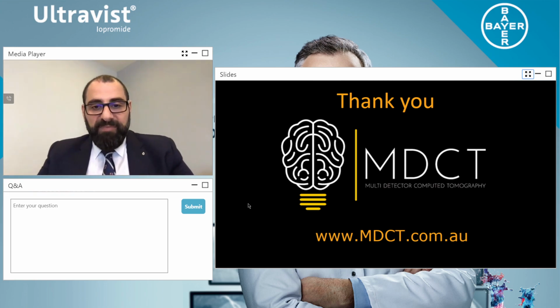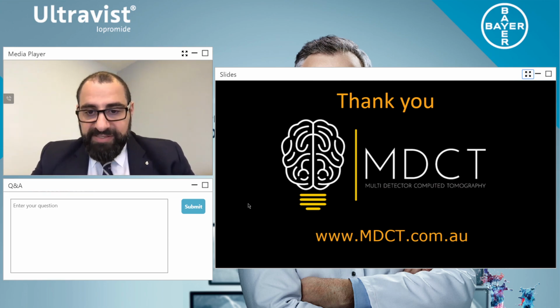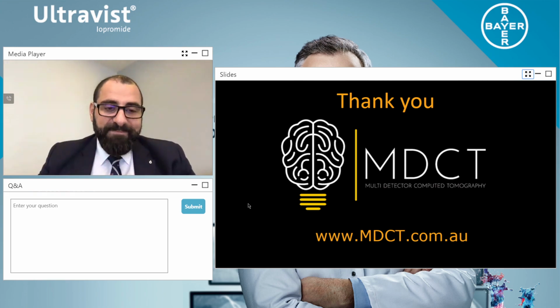Another question from Tsun Wei Hu. As a protocol we use in Hong Kong for liver CT imaging, we only allow for a 5-minute delay. Would you say that that's not long enough for most liver disease differentiation? Fantastic question. Look, I prefer to have 8 minutes. If you can add another 3 minutes, that'll be fantastic. But again, really have to think about this.